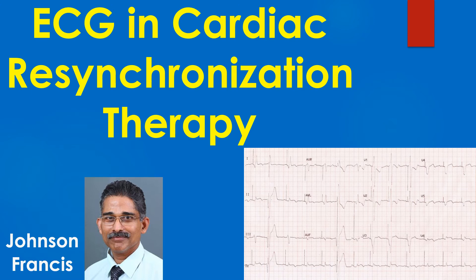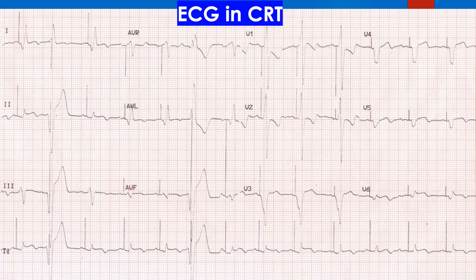ECG in Cardiac Resynchronization Therapy or CRT. While evaluating an ECG in CRT or biventricular pacing, we have to decide whether the device is capturing both ventricles or only one ventricle. In lead 1, a positive QRS is indicative of right ventricular pacing, while biventricular pacing shows a negative QRS — almost like an inverted pattern compared to RV pacing.